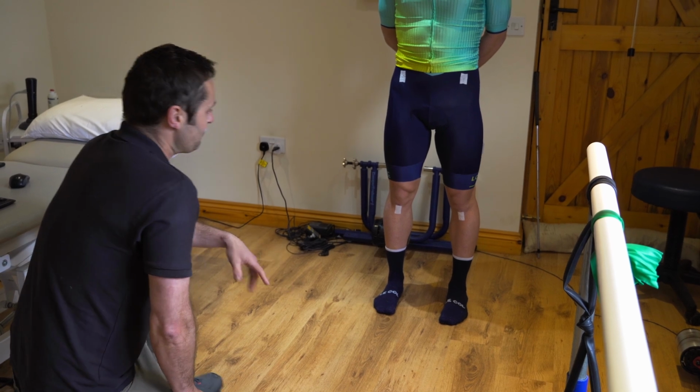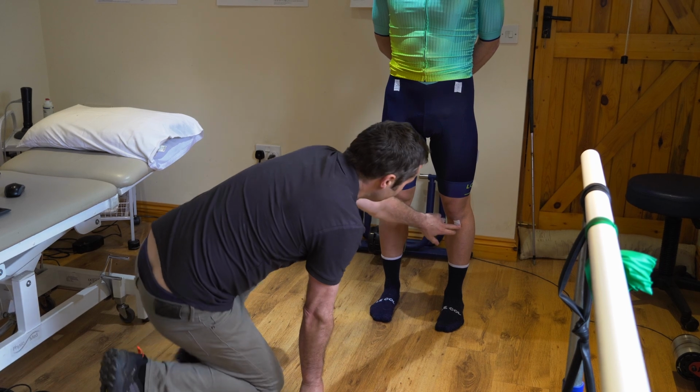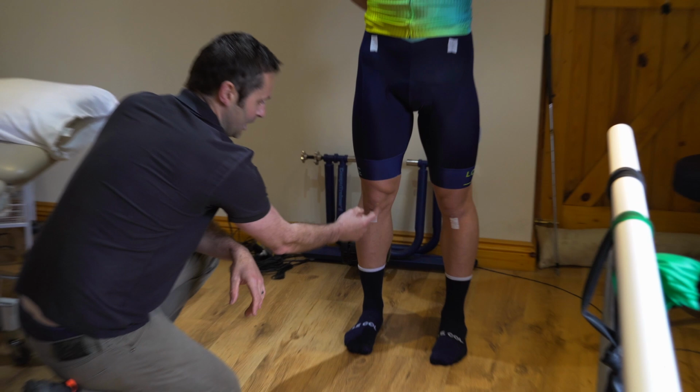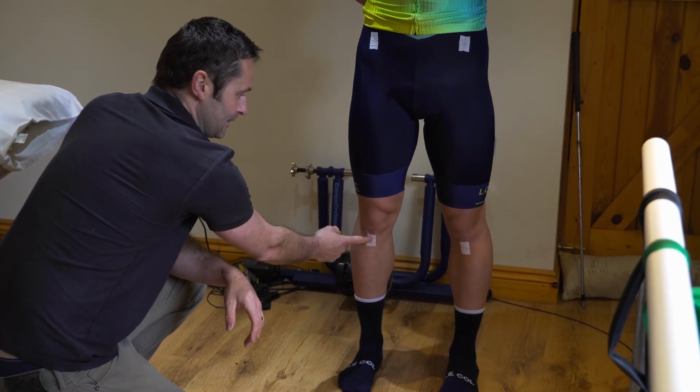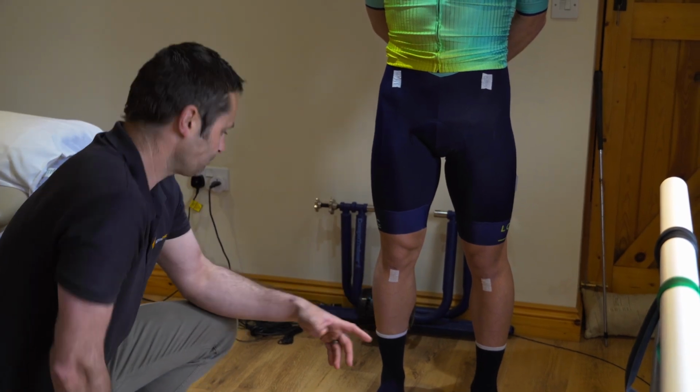So these white sticky dots here are on these bony landmarks, these tibial tuberosities. That's where all your muscles come down from the thigh onto the kneecap and then onto the top of the shin bone here. And it's a really good marker to see what's going on with the knee tracking.